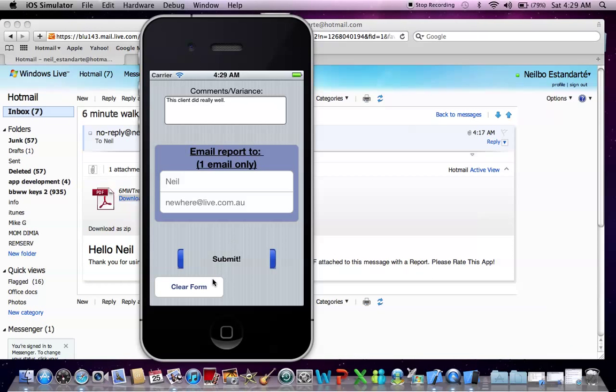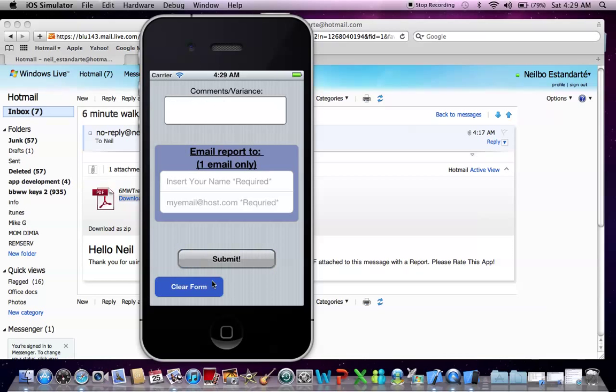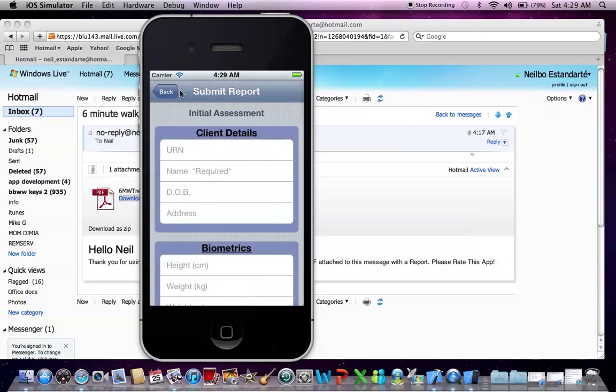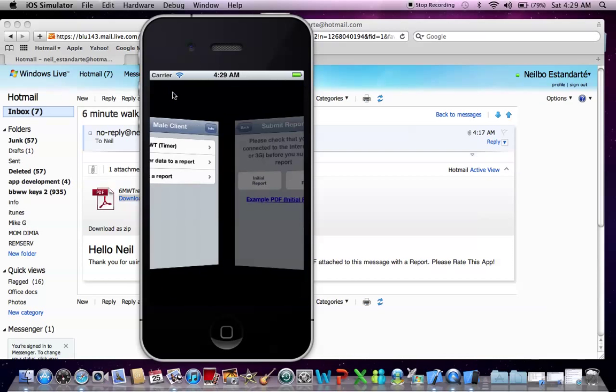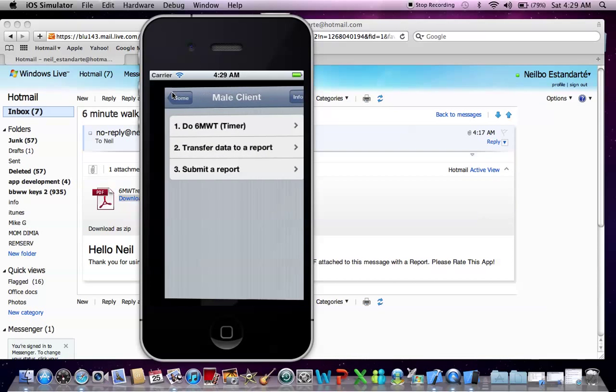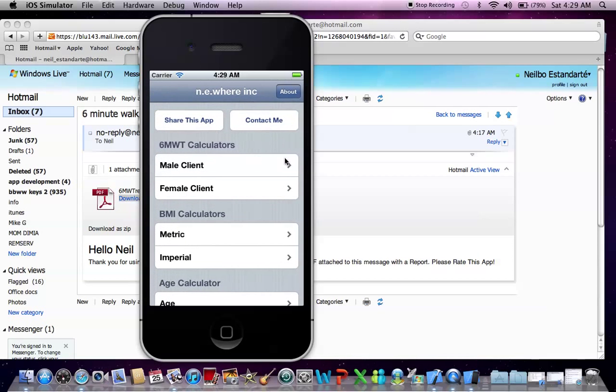So I'm going to close that down. Now I'm going to clear the form. And go back. And there you have it. So, guys, please rate this app, and also contact me if you have any feedback. But I hope you enjoyed the demo. Thanks. Bye.